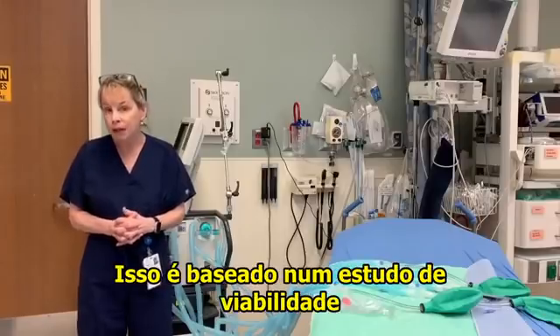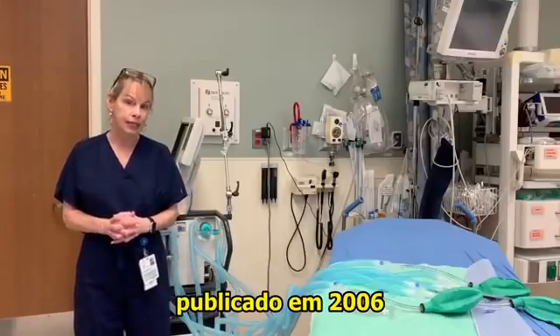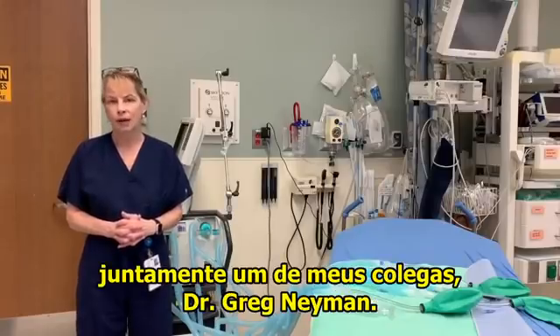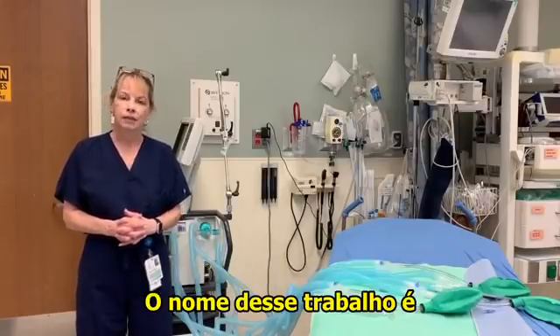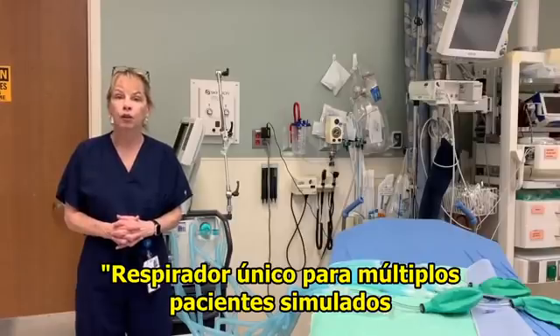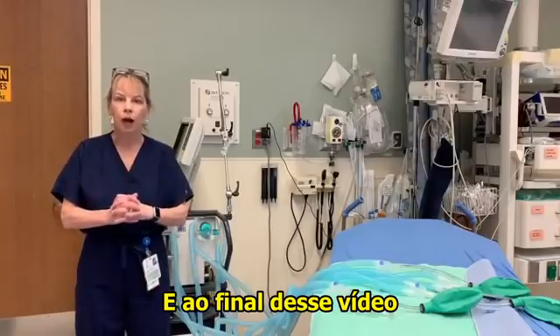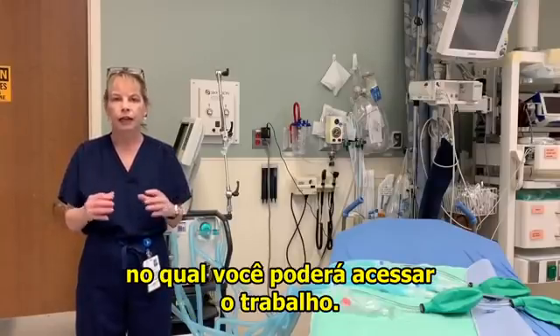It's based on a feasibility study published in 2006 in Academic Emergency Medicine with one of my colleagues, Dr. Greg Neyman. The name of that manuscript is 'A Single Ventilator for Multiple Simulated Patients to Meet Disaster Surge.' At the end of this video, I'll provide a link so you can click on it and go to the abstract.